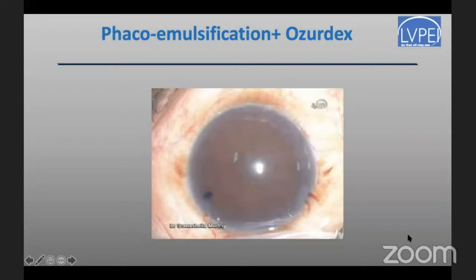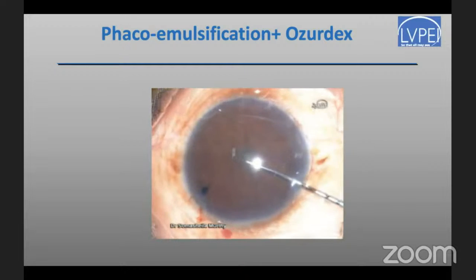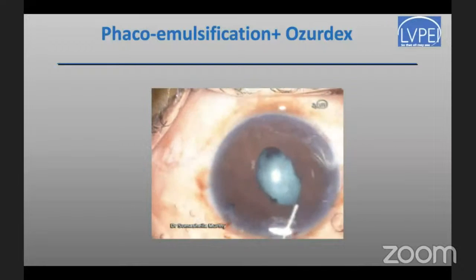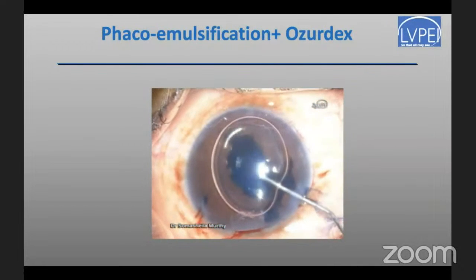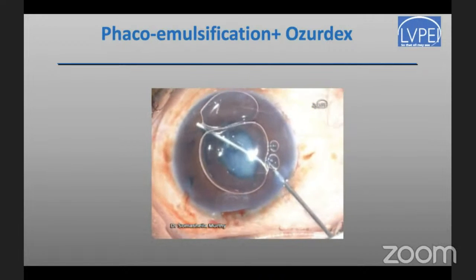This is a 29-year-old patient who had recurrent uveitis, is HLA-B27 positive, and has a small bound-down pupil with hardly any vision due to an occlusive membrane. Also, you can notice that there is a peripheral iridotomy due to past episodes of secondary angle closure or pupillary block. So this patient underwent cataract surgery. First of all, after injecting viscoelastic, using a Sinskey, a small portion is selected where you can insinuate the Sinskey below that. Through that, we can apply Kuglen hooks, as you just saw me do. And after staining the capsule, we can have a very good capsular rhexis.